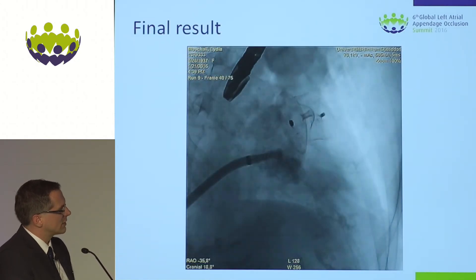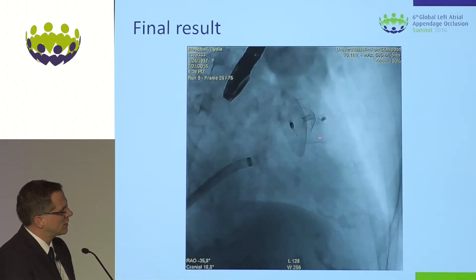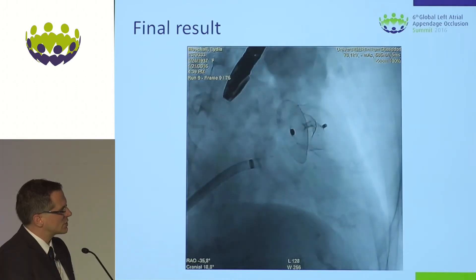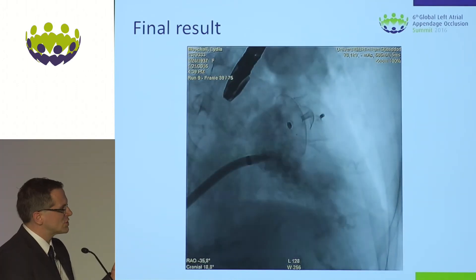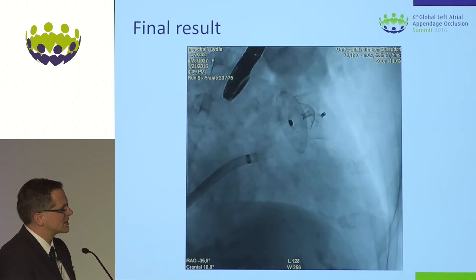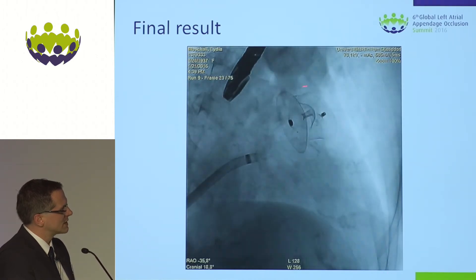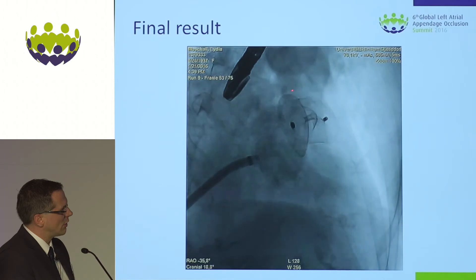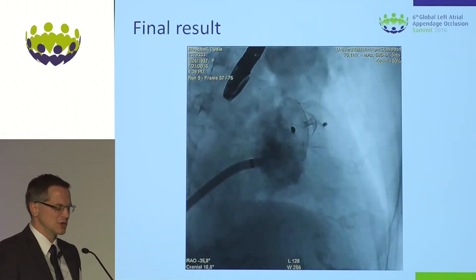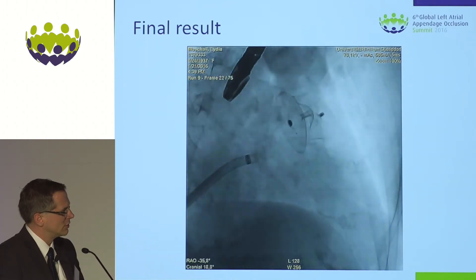The final result on fluoro — you see this huge occluder, the 31 Amulet, with the circumflex and some calcified structures which we matched and positioned in echo using the marker which helped us. The disc is closing most of the orifice, but with this long ridge there are a few millimeters up here which even this large occluder wasn't able to cover. Clinically though, I think it's a good result.